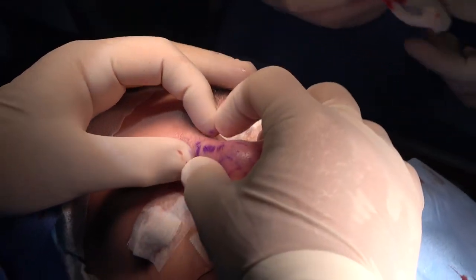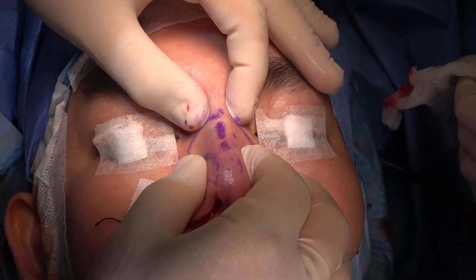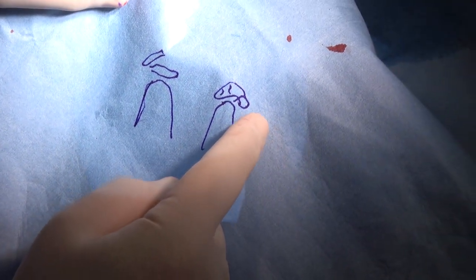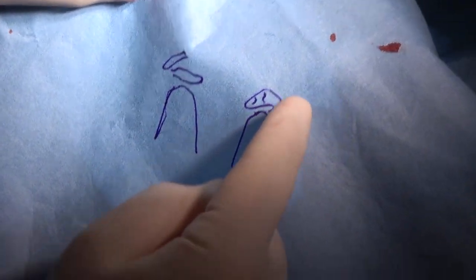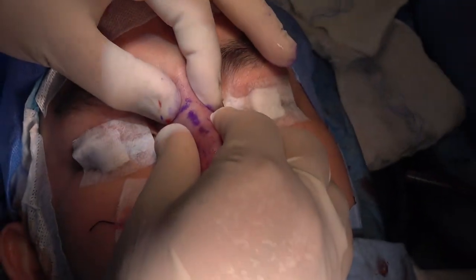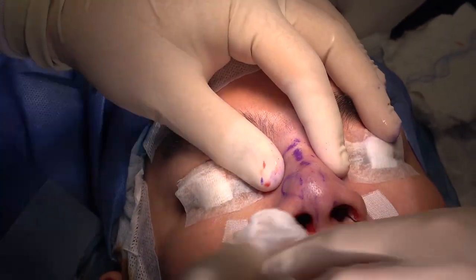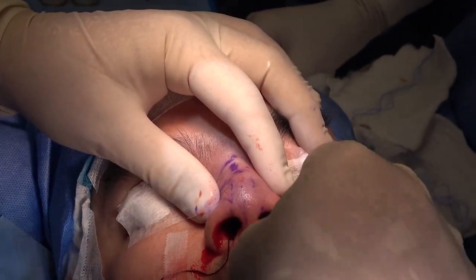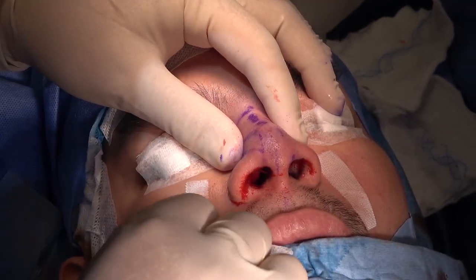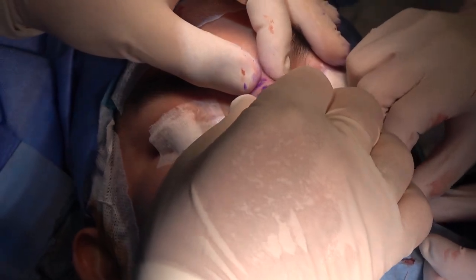And you see now, when I press now on the skin like this, you never see the edges. Because the graft, as we say, is now taking this shape, so it's supposed not to warp now. You significantly reduce the possibility of warping of the graft with this cross-hatching. You see, there is no edge at all. So you reduce both the possibility of warping and also the possibility of demarcation of the flap.